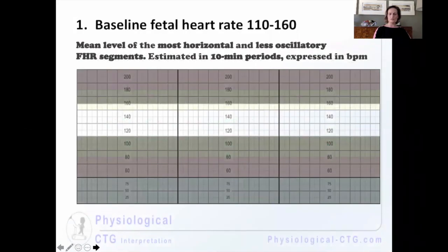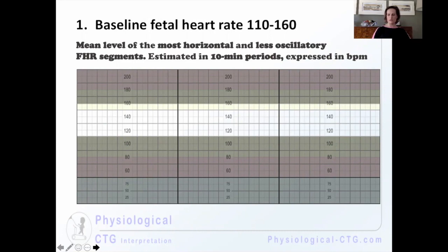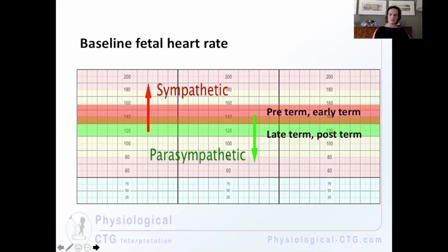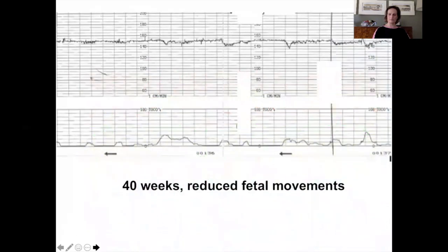Many people ask: what do you mean by a baseline appropriate for gestation? Normal baseline in most guidelines is between 110 and 160, but this is for the population of babies at term between 37 and 42 weeks. Babies at preterm or early term tend to have a baseline on the higher side of normal, while babies that are late term or post-term should be on the low side of normal. As a rule of thumb, over 40 weeks you expect the baby to be less than 150 beats per minute for the fetal heart baseline.